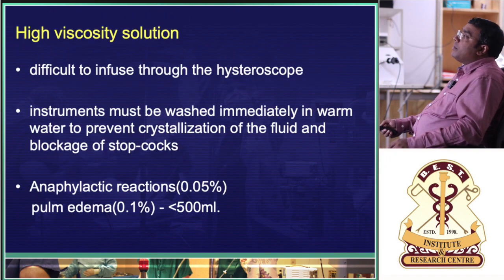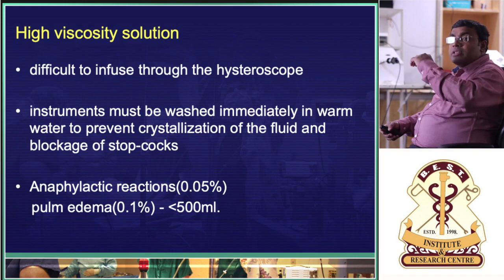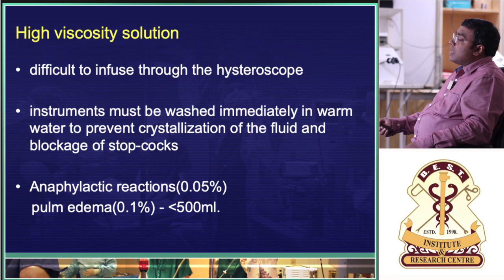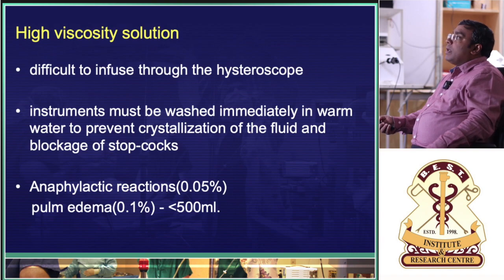But what are the problems with this? It is difficult to infuse through the hysteroscope. Instruments must be washed immediately in warm water to prevent crystallization of that fluid, and it may cause blockage of the stopcocks. So as soon as you do the case, you have to wash it, or else it will undergo crystallization. Then there is a 0.05% chance of anaphylactic reactions. Pulmonary edema is around 0.1%.